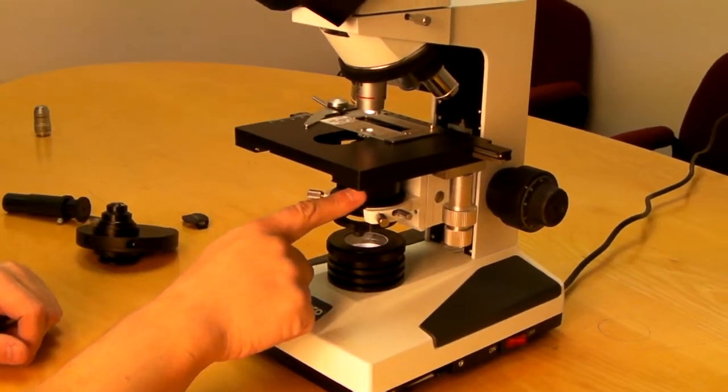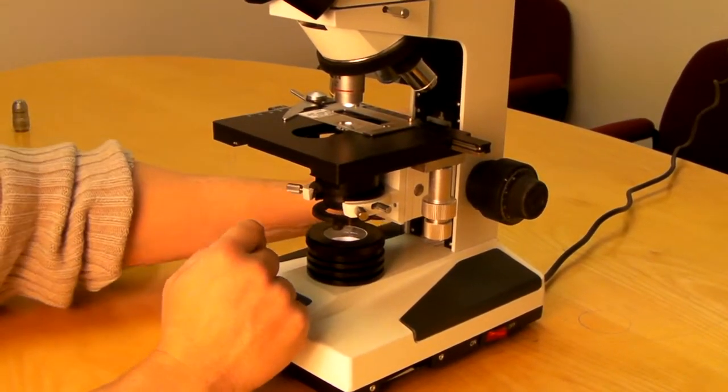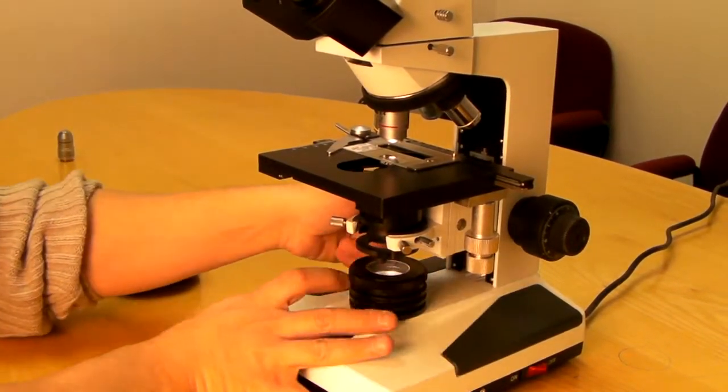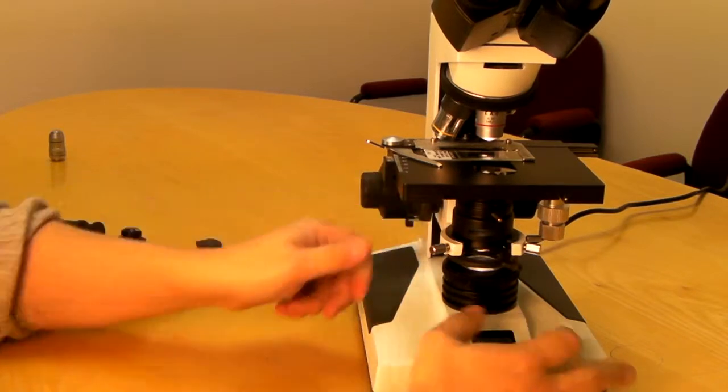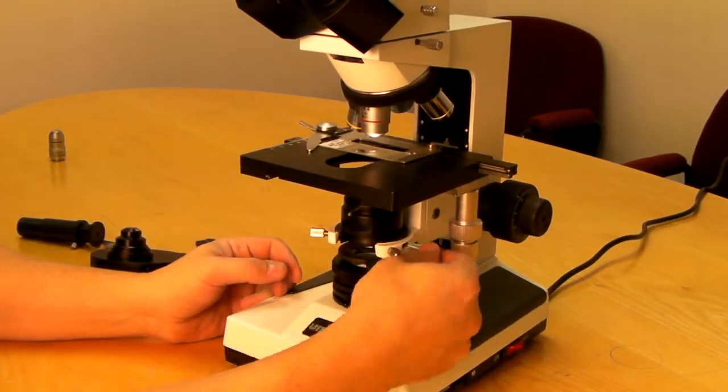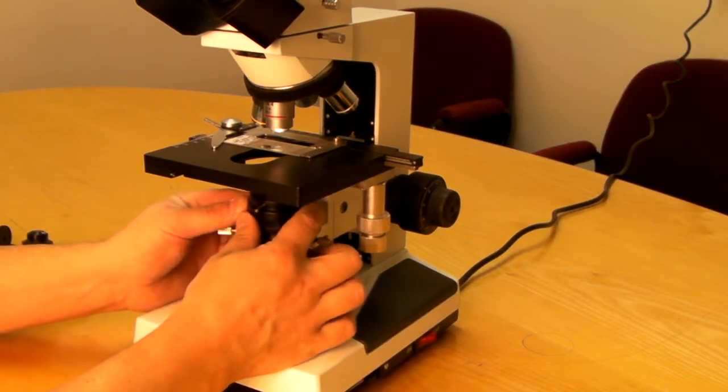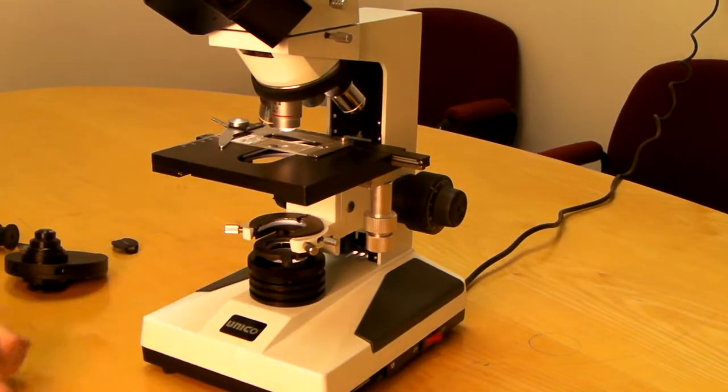First of all, we need to remove the condenser. You need to bring the stage all the way up and your condenser all the way down. Release the condenser and carefully remove it from its holder.